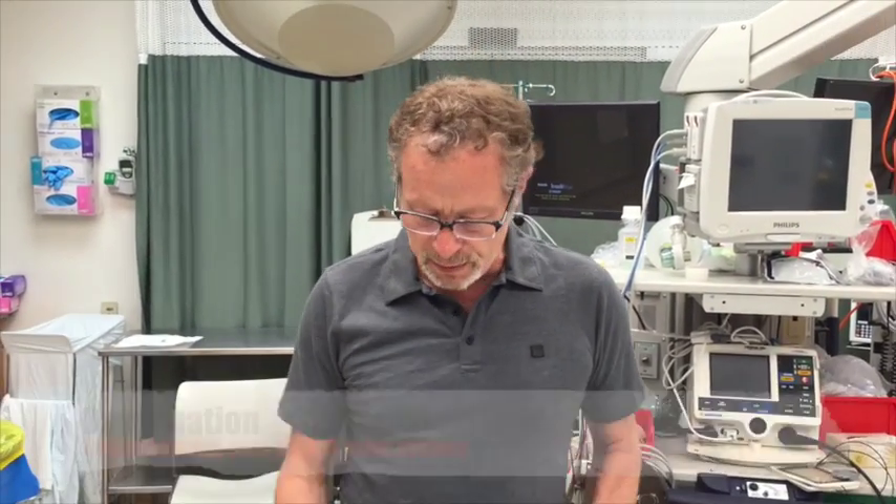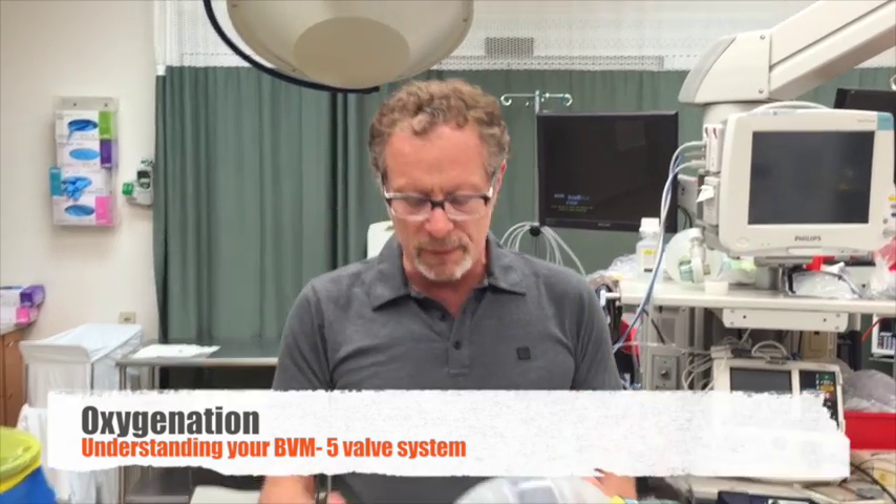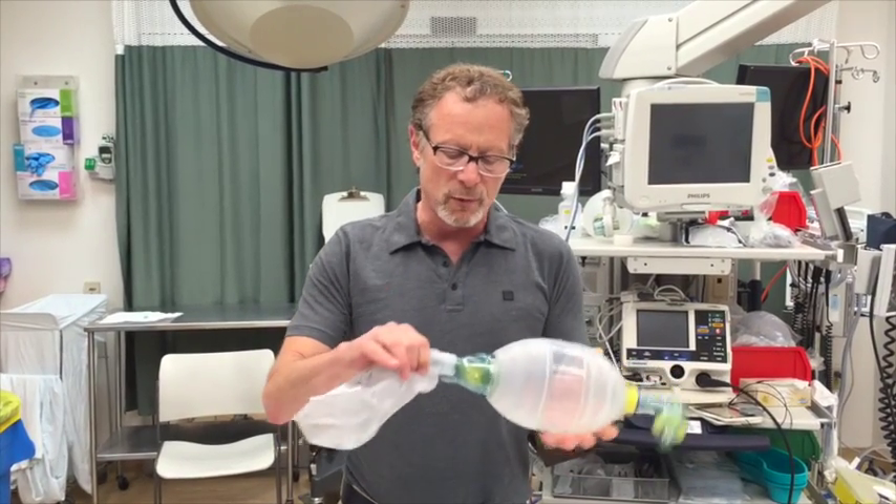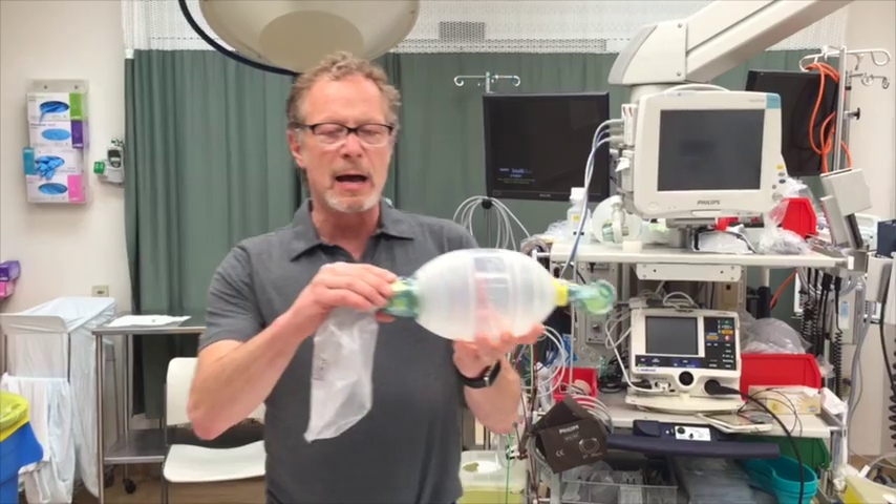Just a quick session to follow up on understanding your BVM. We have two devices. This is the Lairdell system, and just to review the components: we have a reservoir bag and we have two valves in the back.